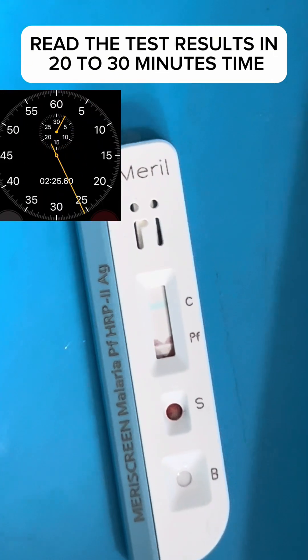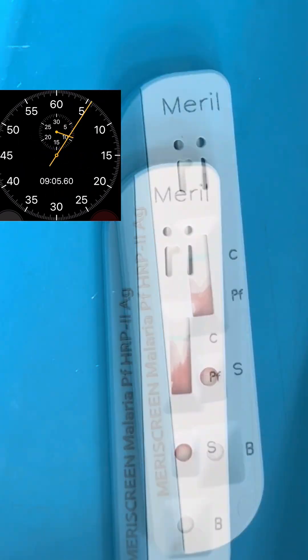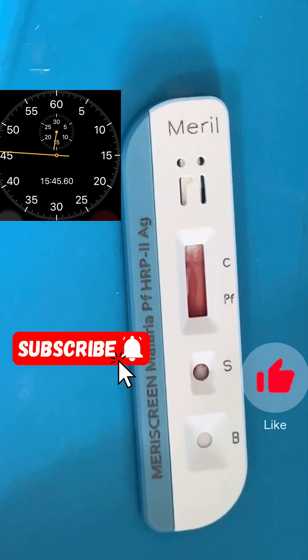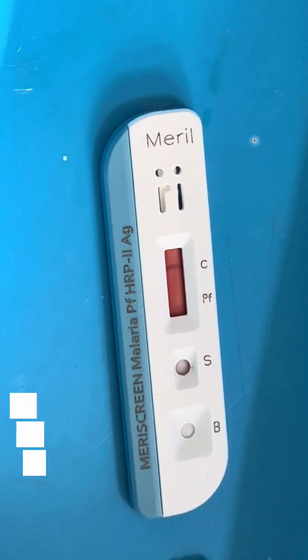Gently squeeze the buffer bottle over the buffer well B and apply four drops of the buffer solution. Read the test results in 20 to 30 minutes' time. It is time to read the results from the test kits and document your findings.